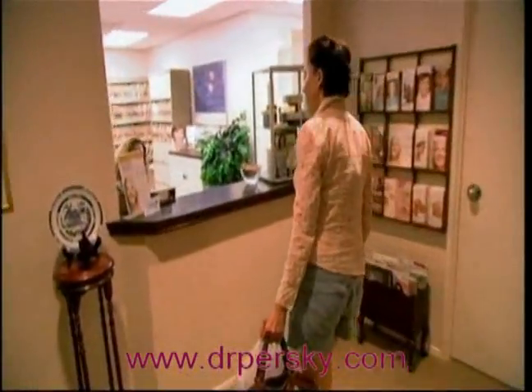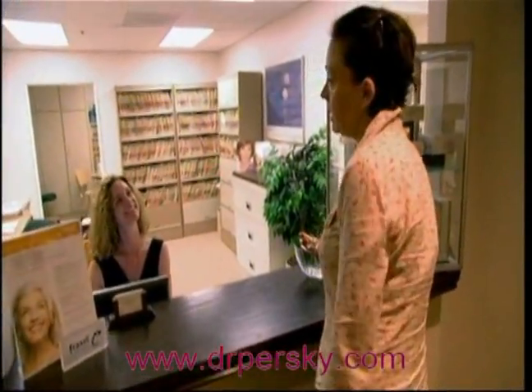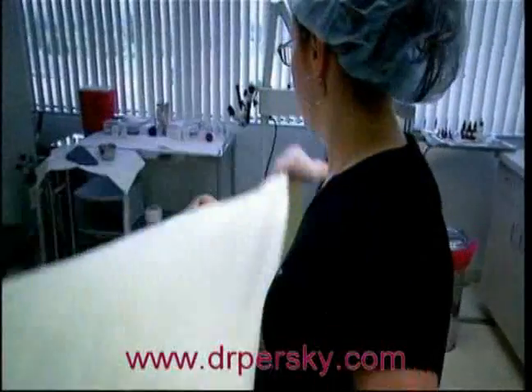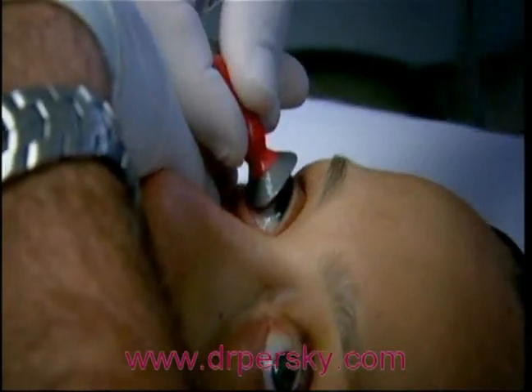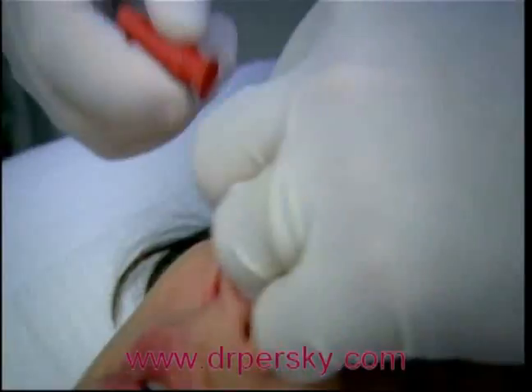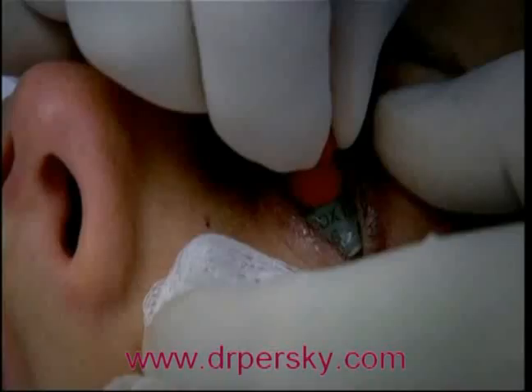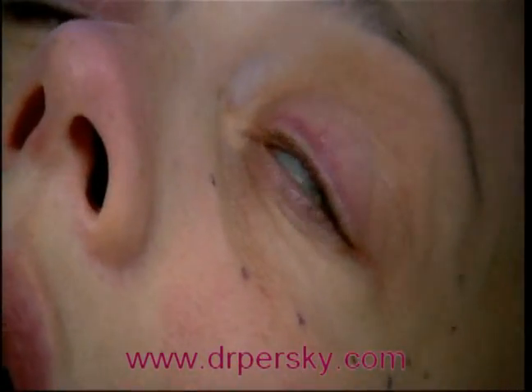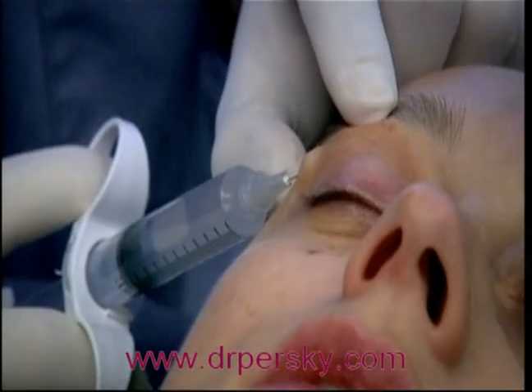Hi. I'm good, thanks. Here to see Dr. Persky, obviously. Demerol, Xanax, Vicodin. Safe to say, I'm out of it enough not to mind metal shields being put onto my eyeballs. Is it uncomfortable? Okay, now open your eyes. Or the area around my eyes being injected with local anesthetic.